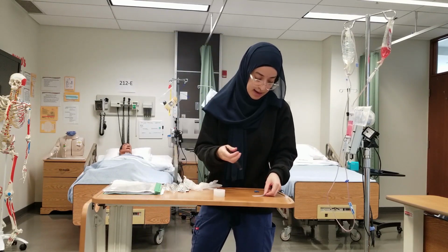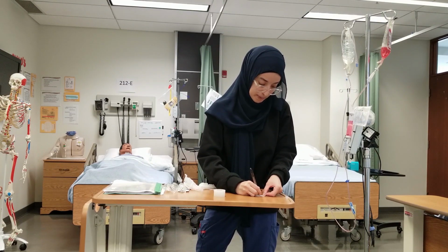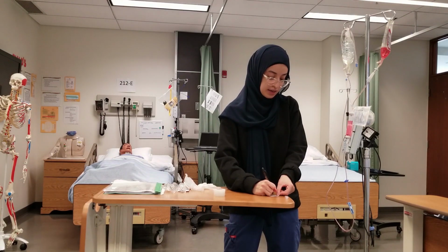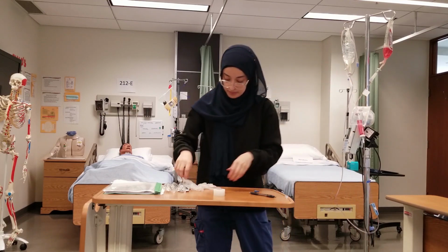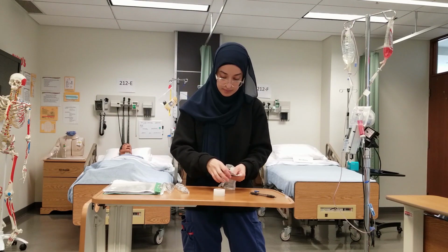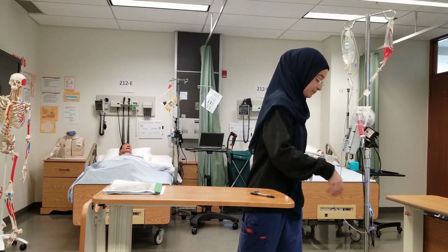I'm going to go ahead and label my tubing with just blood, even though it might be obvious to the eyes. It's good to get in the habit of labeling any type of medications that you're giving. So we're going to enter our patient's room now.